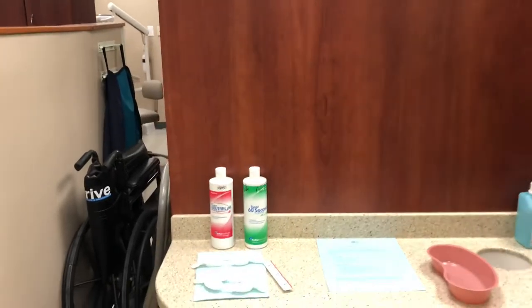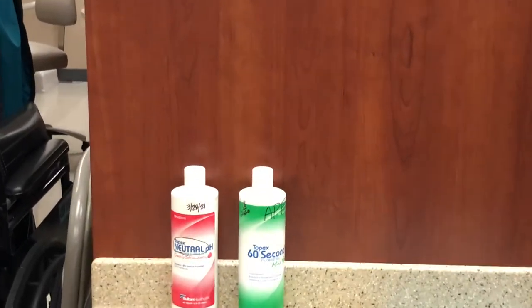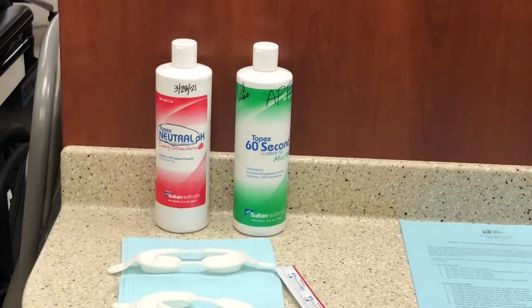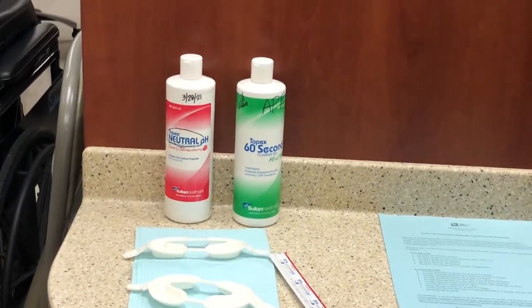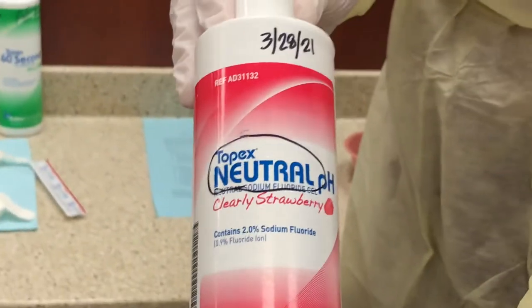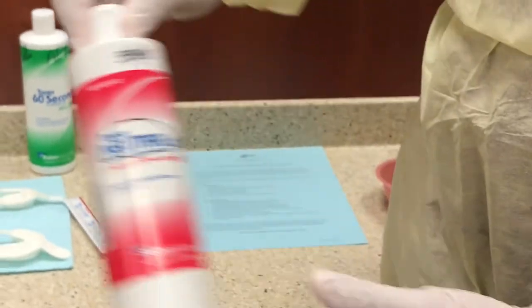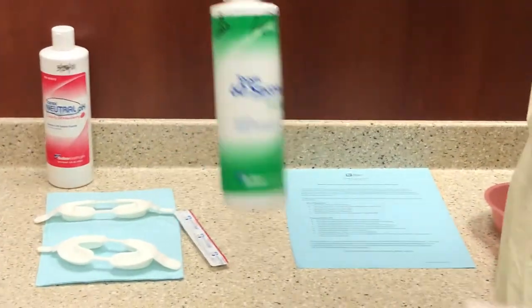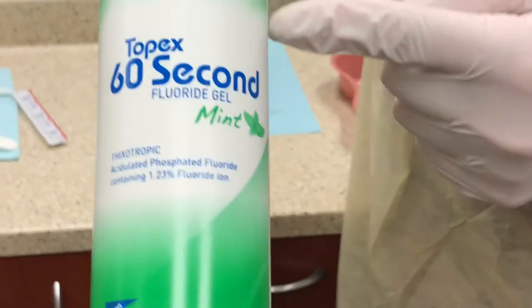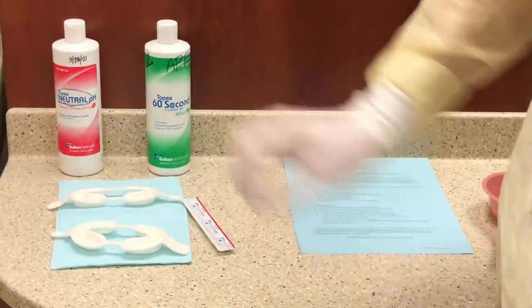We will not have the actual bottles of fluoride out during your procedure; this is just out so that you can see the different variety of product. We have neutral product that is for any type of tooth-colored restoration or sealant, and then we have the APF which would be for any teeth that do not have any type of filling, or that have gold or amalgam fillings — so anything that is not tooth colored.